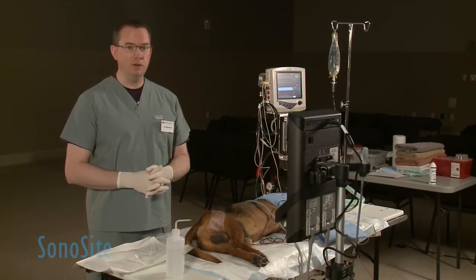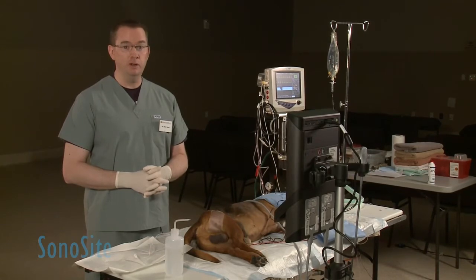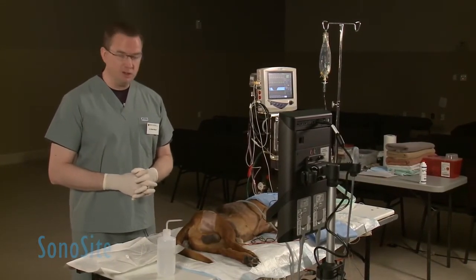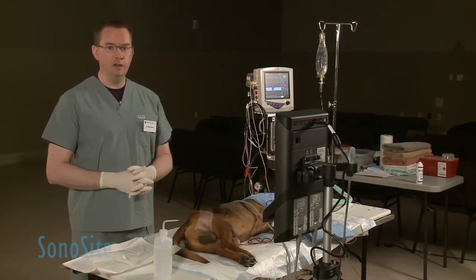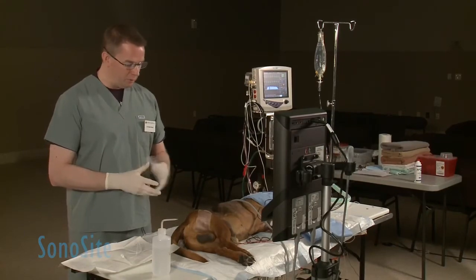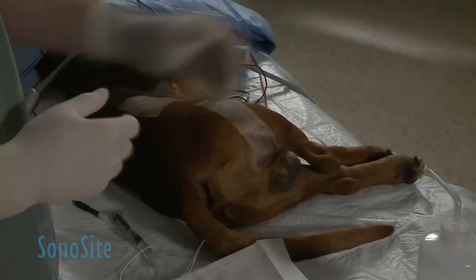Welcome. Today we're going to be doing a demonstration of an ultrasound-guided sciatic nerve block in the dog. This procedure is used to provide local anesthesia, regional anesthesia, and post-operative analgesia for procedures typically distal to the stifle on the dog.